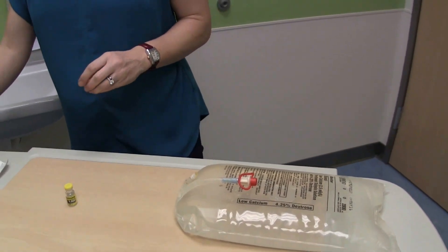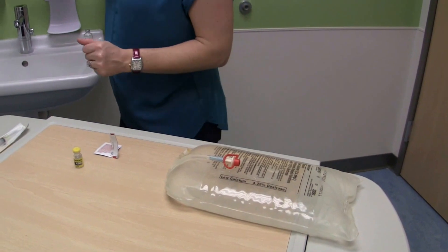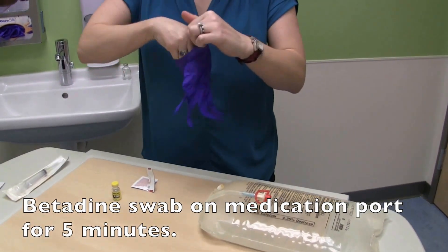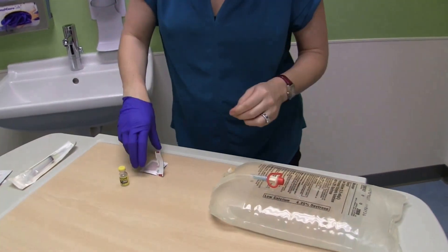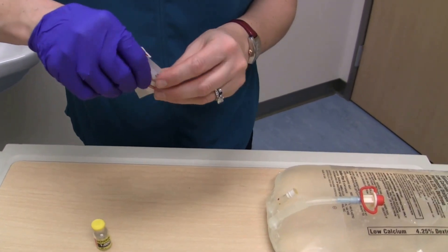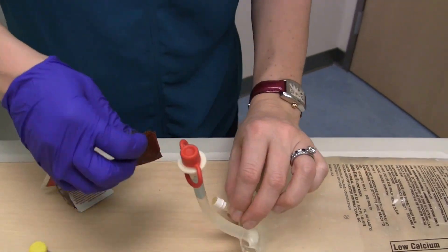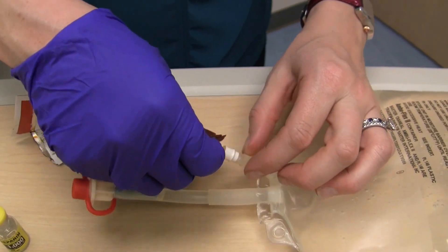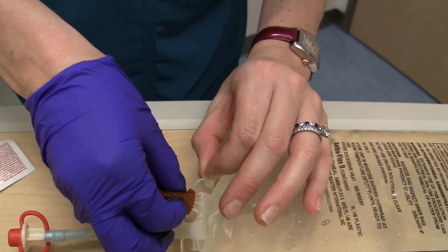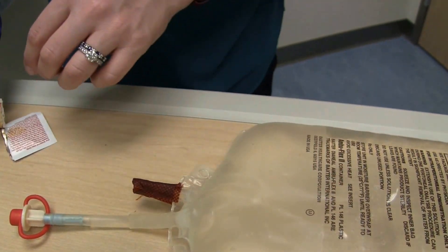The first step here is to go ahead and put betadine around the medication port, which is this one right here. I'm going to put a glove on just so my hand doesn't get so gross from the betadine. I'm going to leave that in place for five minutes.